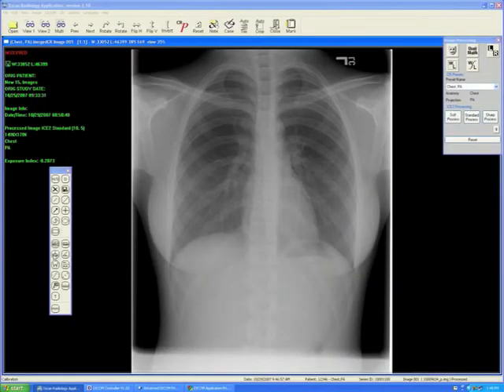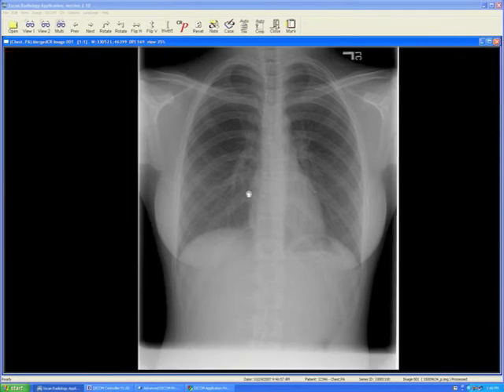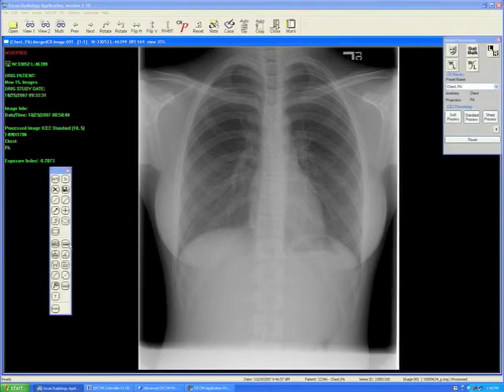Calibration. Our annotations and measurements give us a device to compensate for the magnification distortion that is inherent in all X-ray imaging. As per this example, I am going to measure a structure, in this case the heart. I get a measurement of 100.09 millimeters, and I want to compensate for magnification of this anatomy using this marker here as a known device for its size.